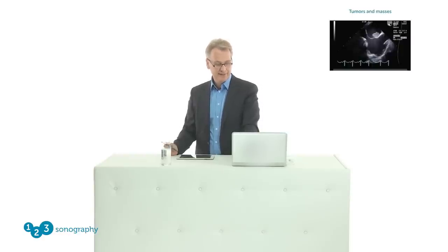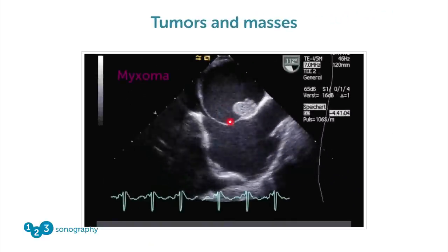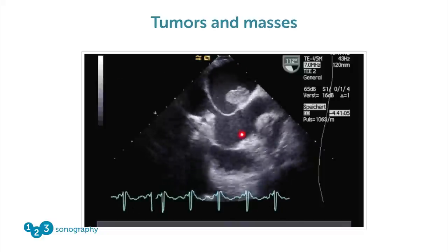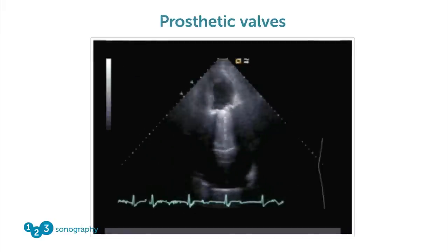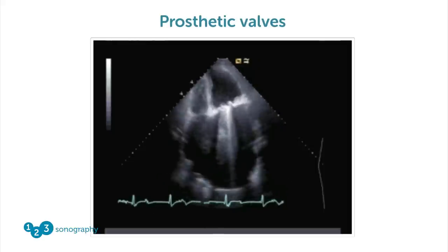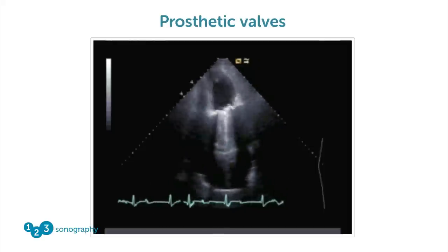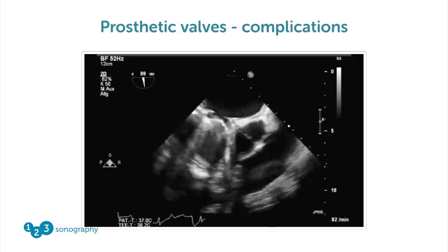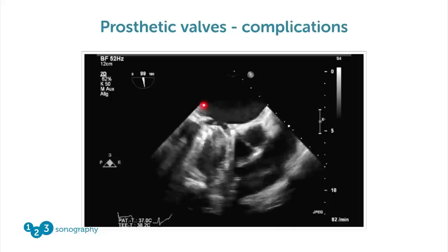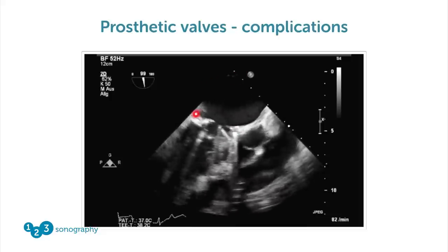One of the strengths of TEE is that we can look at tumors and masses — an example of a myxoma seen on the interatrial septum. TEE also permits us to look at prosthetic valves, which are very difficult to image from a transthoracic approach due to shadowing. But if we perform a TEE, we see the left atrium very nicely, and that's where we have most of the pathologies.